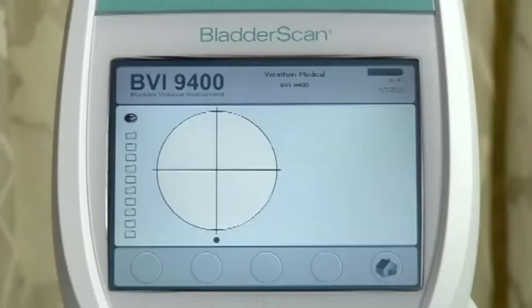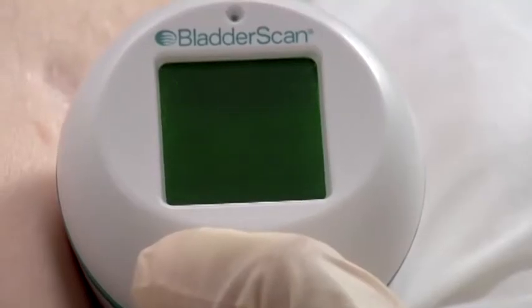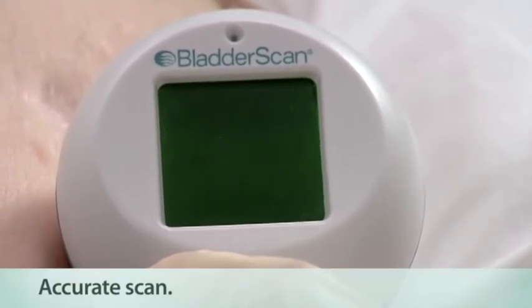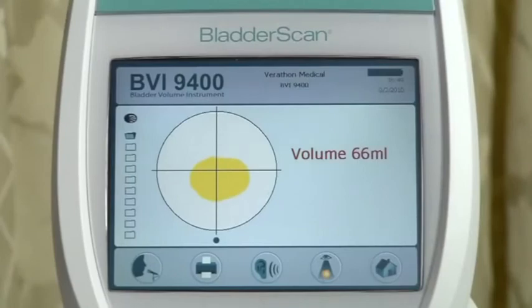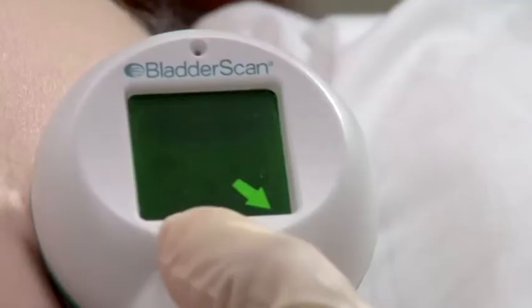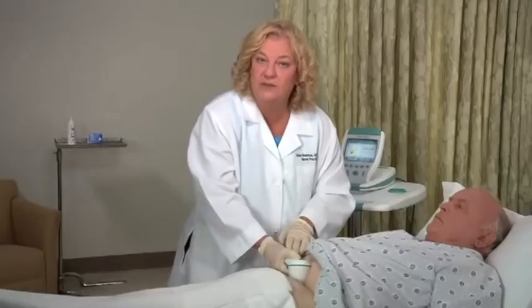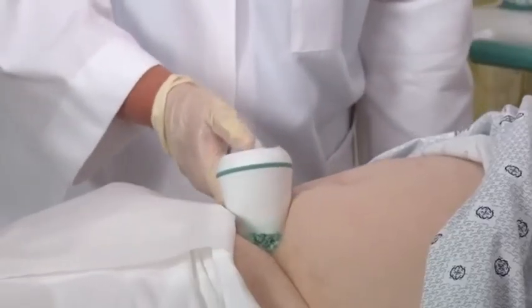When you hear a beep, the scan is complete and the bladder volume measurement is displayed on the console. You know the aim is accurate when you see all eight arrows are flashing on the probe and the bladder image is centered in the crosshairs of the console's aiming icon. If the scan is off target, the arrows on the probe indicate the direction of the bladder. Using these arrows, re-aim the probe for a more accurate scan.